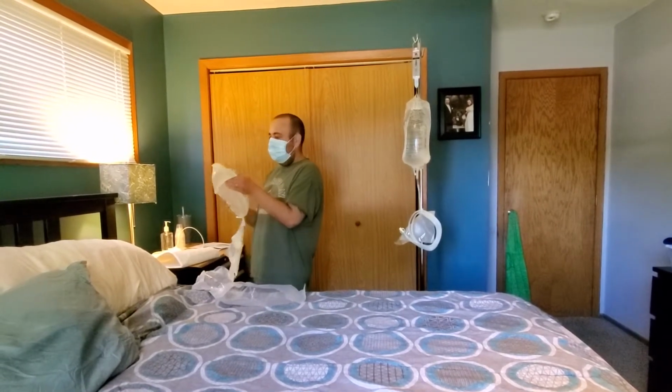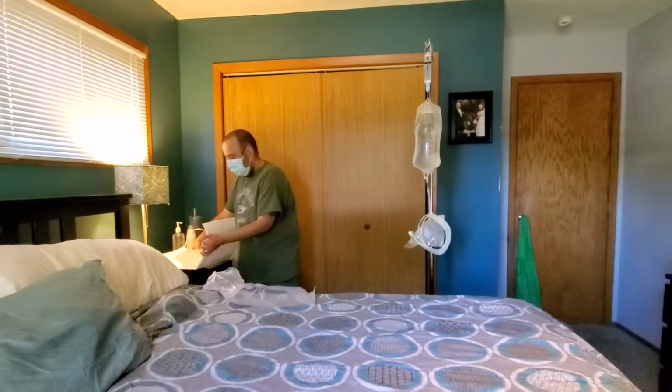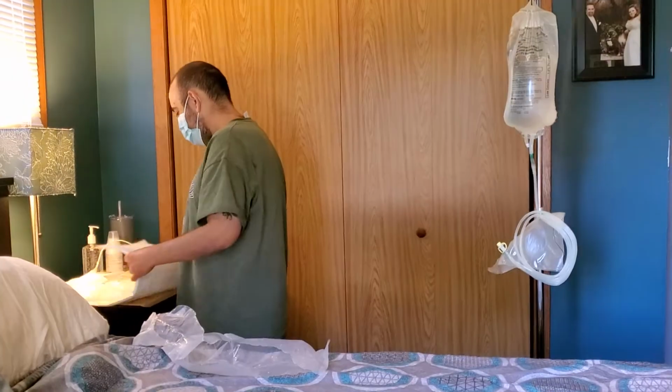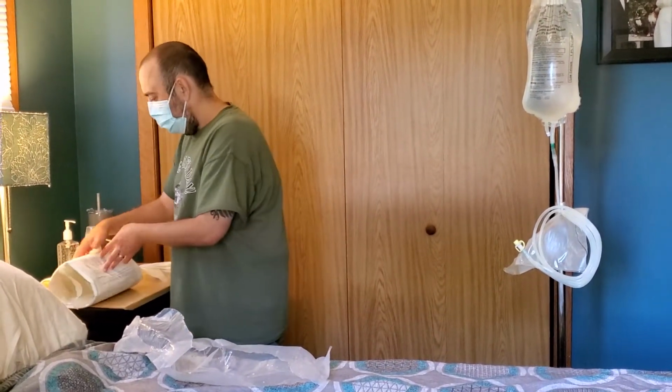For the manual transfers, I just have a heating pad, and it takes a while to heat that up, so I'm actually starting the second bag so that it's ready for the next cycle.